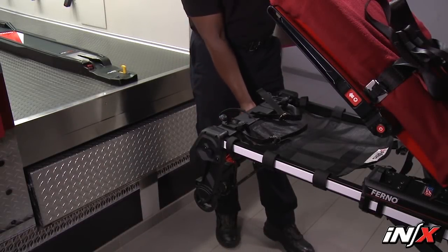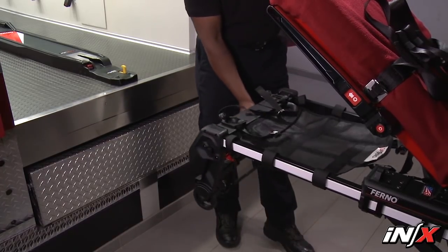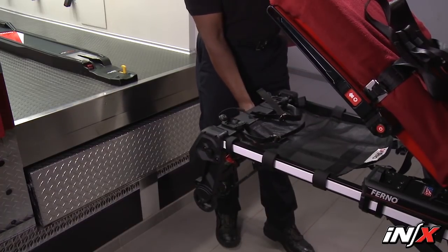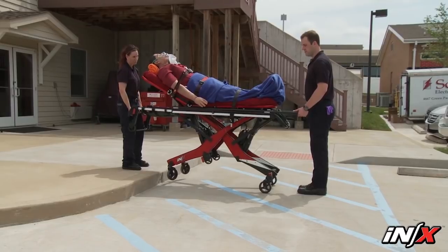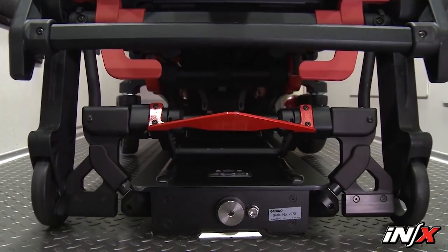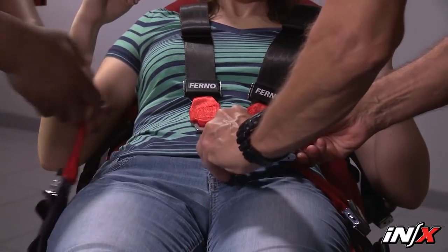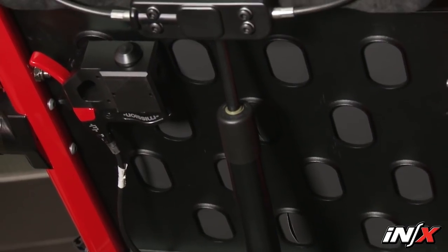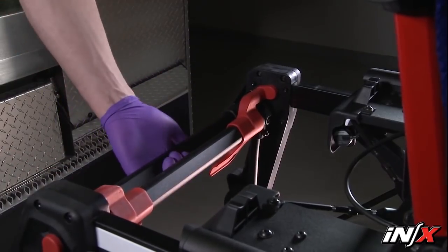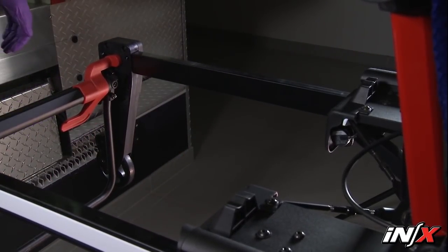The telescoping frame shortens the NX to improve maneuverability in tight spaces. There are two locked positions: extended for normal operation and retracted. A third unlocked, fully compressed position shortens the frame to its minimum length. Use only a locked position when lifting the NX. The telescoping frame must be locked in the extended position before loading the NX into an ambulance or unloading it. To adjust the telescoping load frame, loosen or unbuckle the pelvis strap if needed, then raise the backrest. Adjust and fasten the pelvis strap. Squeeze the red telescoping frame release handle and begin pushing or pulling the frame, then release the handle. Continue pushing or pulling until it locks into its new position.